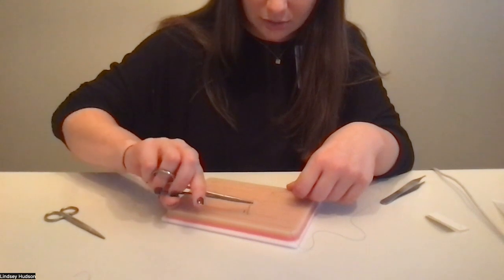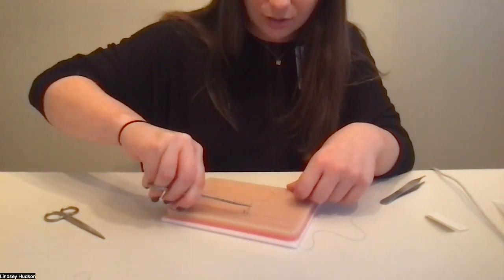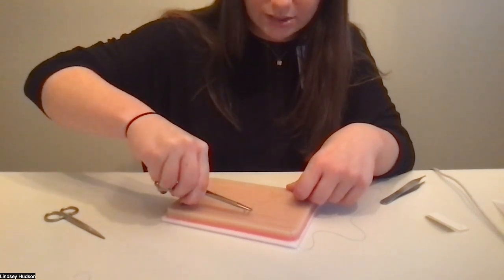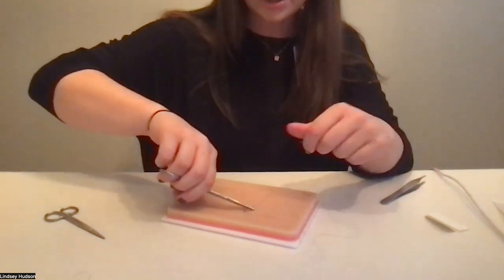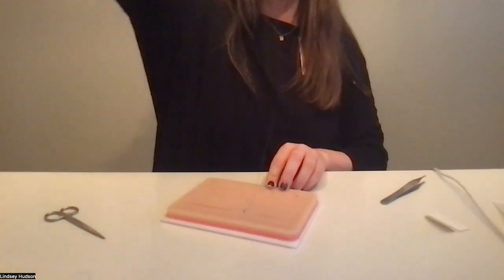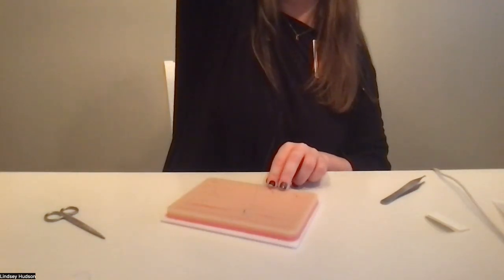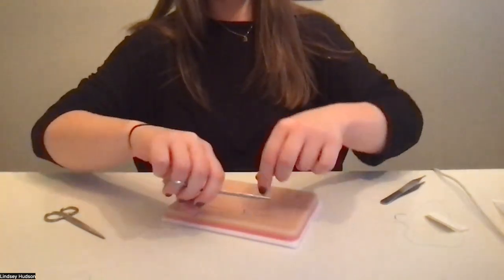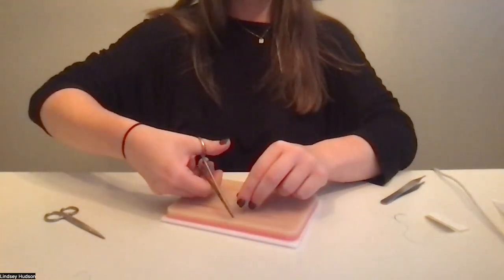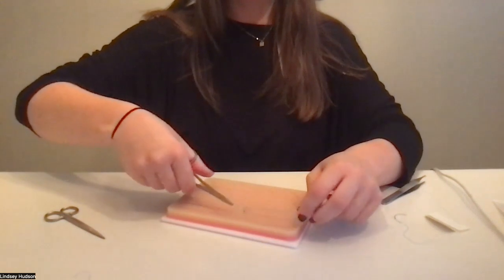So again, going to go in at a 90 degree angle. You're going to twist your wrist like so and come out through the other end. You're going to pull it through and leave yourself about a 1.5 inch tail. You're going to loop twice. Grab your tail and pull it through.